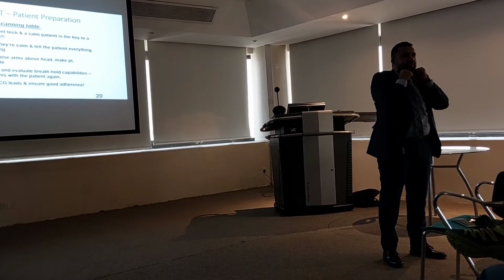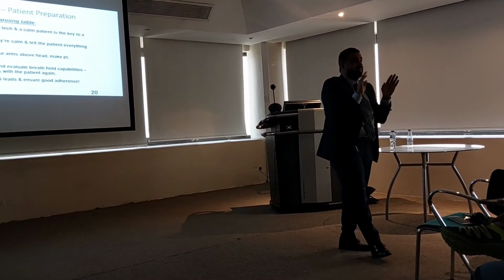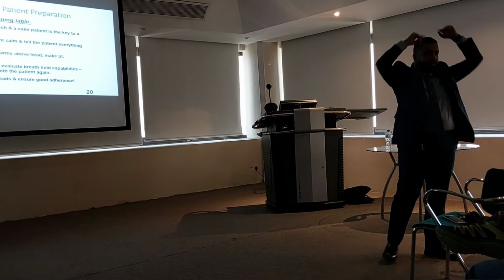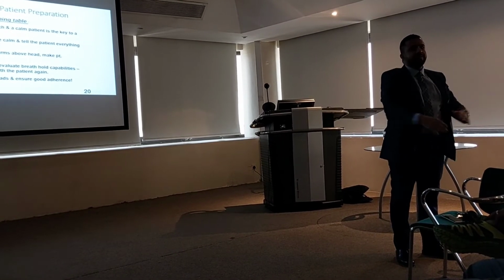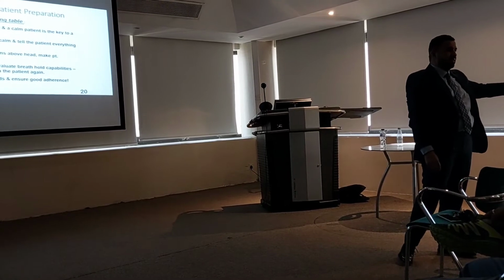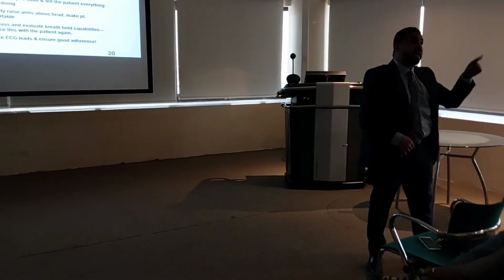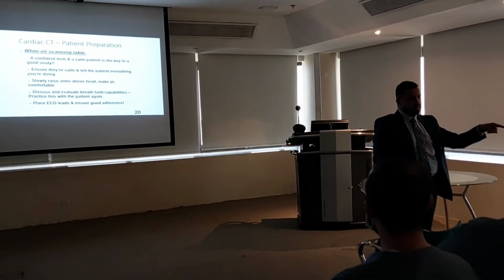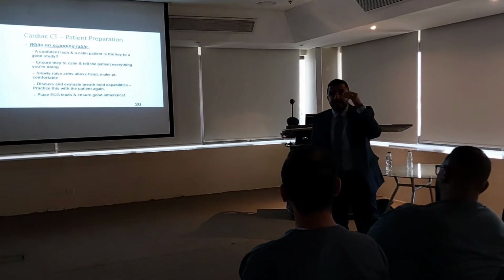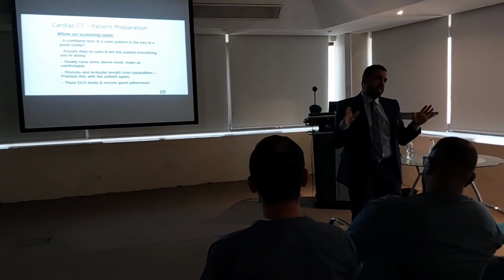Sometimes, especially with the obese patient, it will start touching the chin and that's it. So that's why I started to ask the patient: arms up, position the ECG leads, arms up. Yes, I will proceed with my preparation. When I am starting the scouts, I ask the patient arms up. If I am discussing something in between, I'll ask the patient to relax his arms, and I will get to the main position with the patient relaxed.